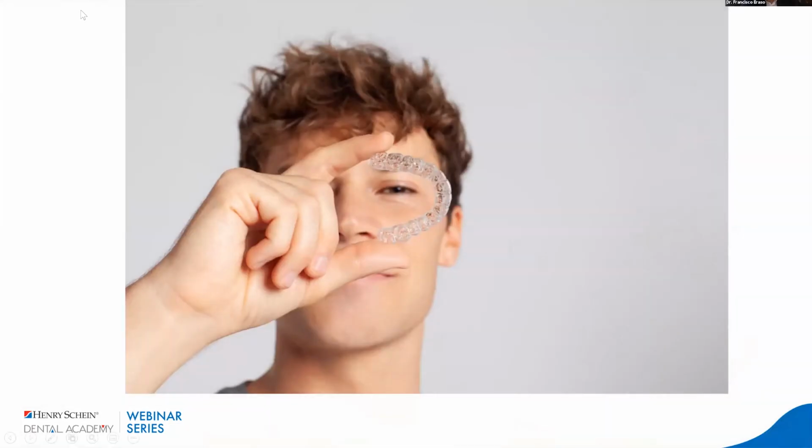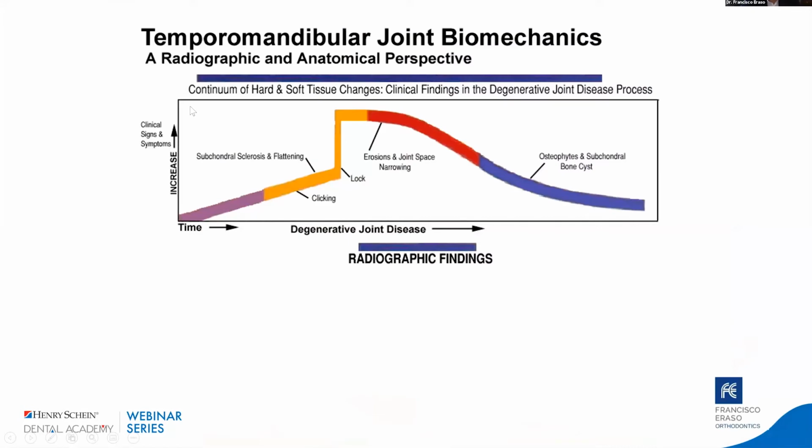Then you have the TMJ, okay? With the TMJ, without going into details, we have clinical signs and symptoms. With the clicking and locking, you're going to have radiographic signs such as sclerosis and flattening. Sometimes in the TMJ, we see erosion. Erosion means degeneration. We're decreasing the articular spaces, so narrowing of the articular spaces.